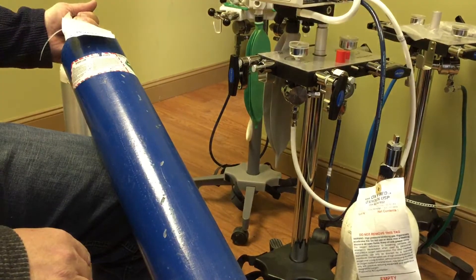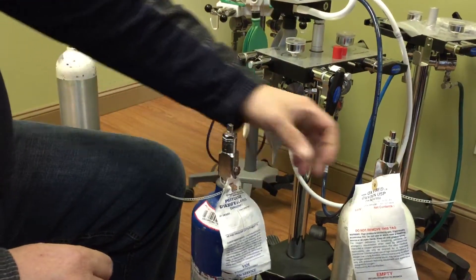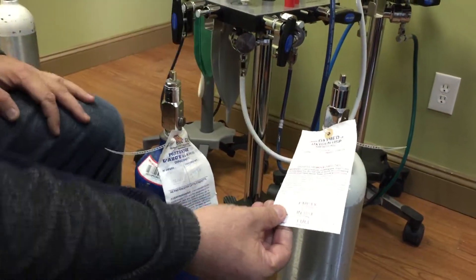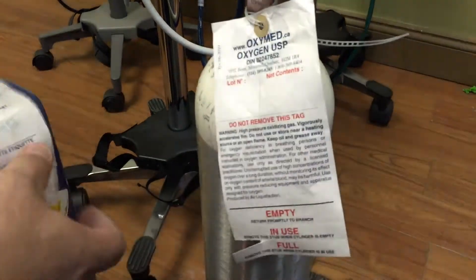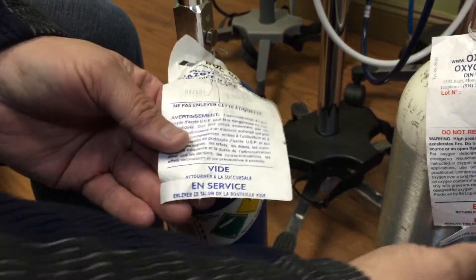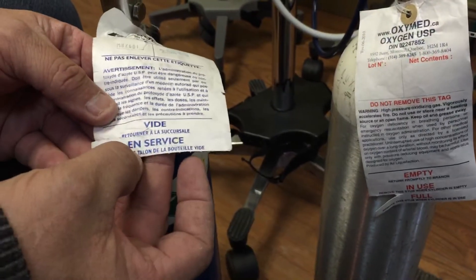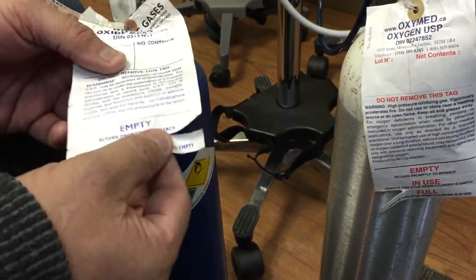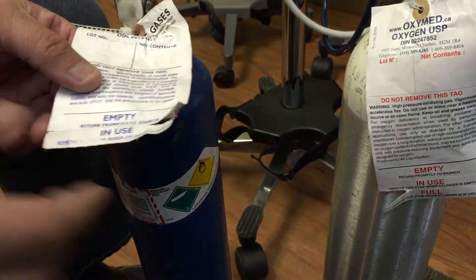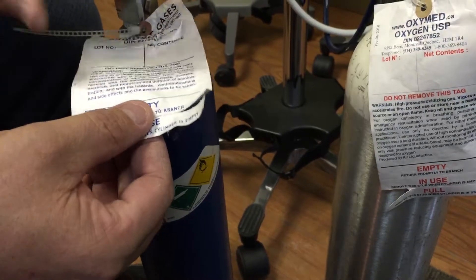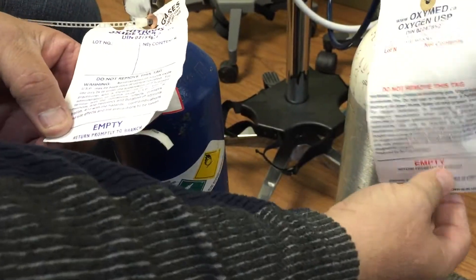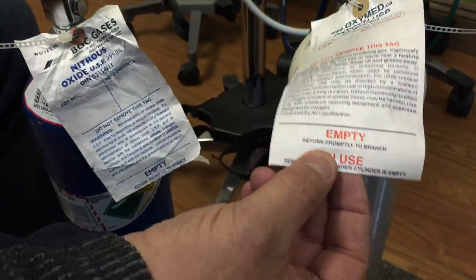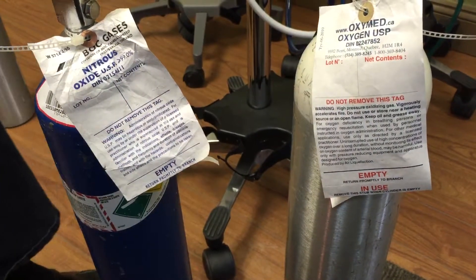Another thing that's very important is this tagging system. Once this tank depletes, we're going to tear off this one, and then the tank will be listed as empty, and that's when we go over to the next gas. Next one, and actually tear it off, and then this one will be in use. If this is forgotten, we're going to be sending full tanks back to the gas supply company.